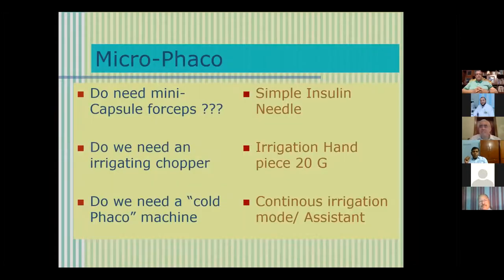But this is not really microphaco, because you still need an irrigating handpiece with a leaking incision. And you have to have continuous irrigation from the assistant only to keep away the corneal burn.